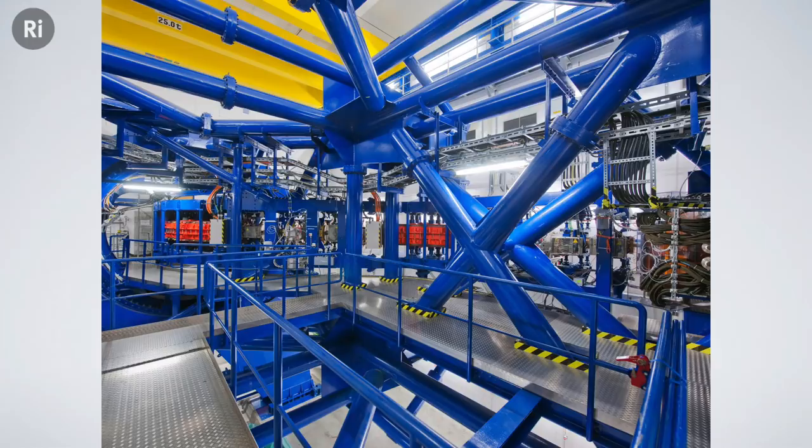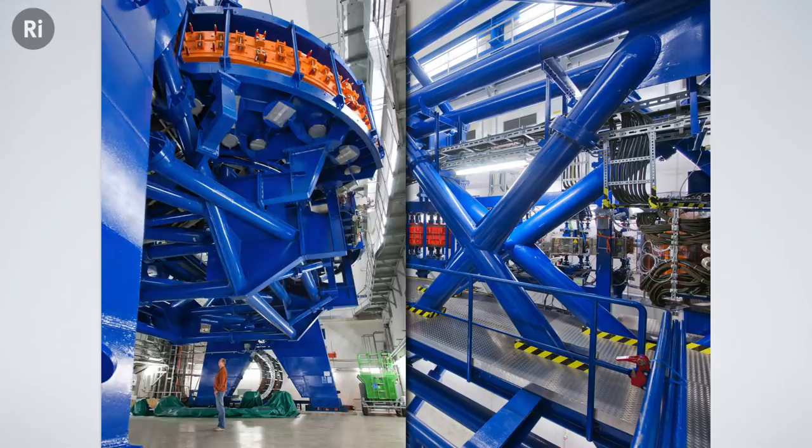right time. Now, to give you another sense of scale about how big these are, this is a view of the gantry with one of the operators standing underneath it. Because he's German, he is bigger than average. He's probably taller than I am. But you get a sense of how big this machinery is.